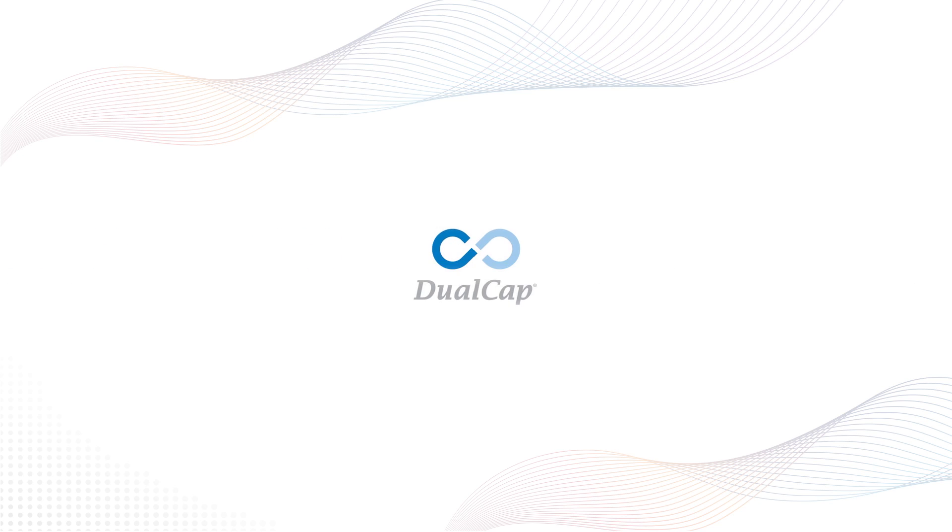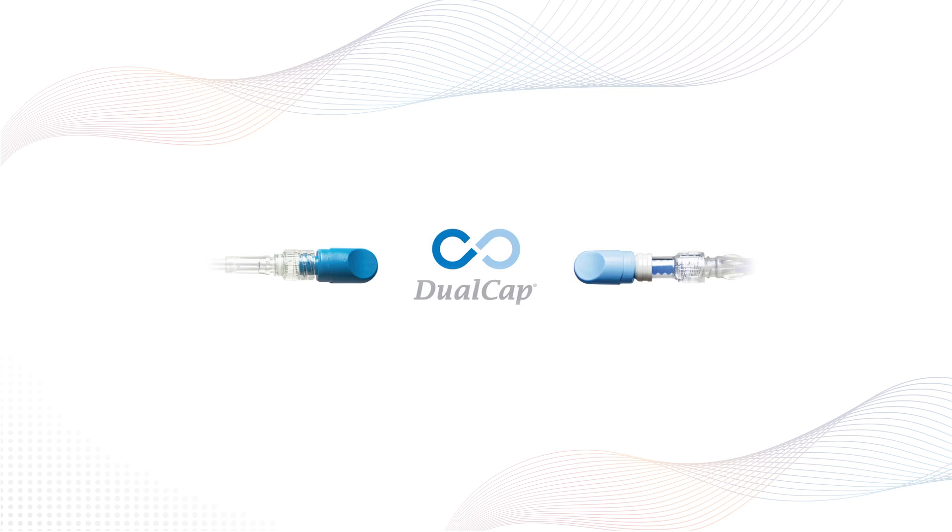Dual cap is a unique addition to the IV line bundle, a disinfection cap system designed for use on needle-free valves and at the end of IV tubing, also known as the male luer connector.